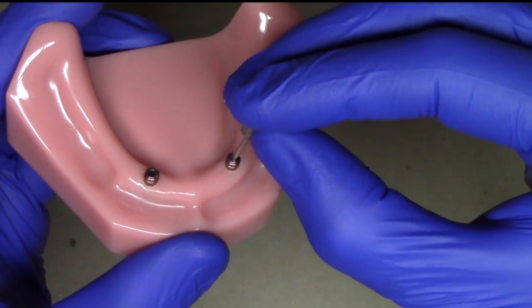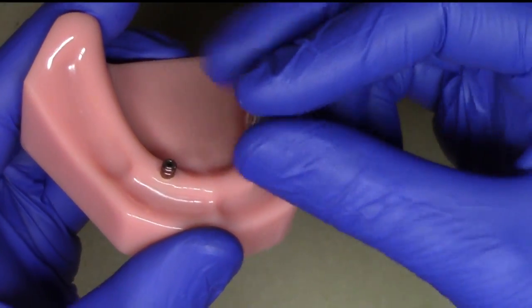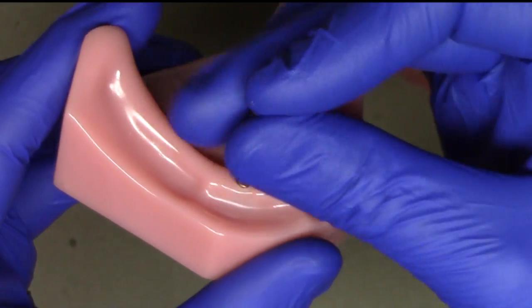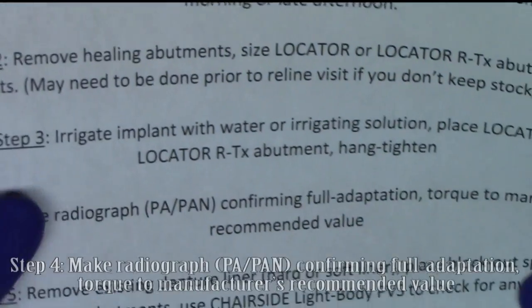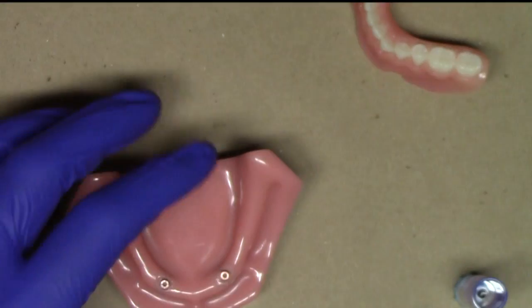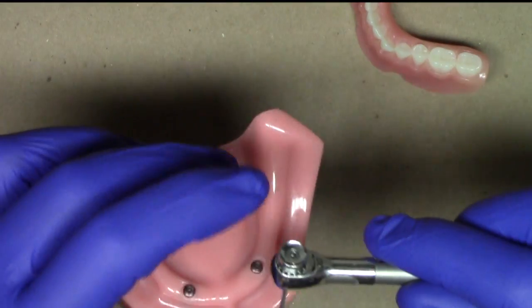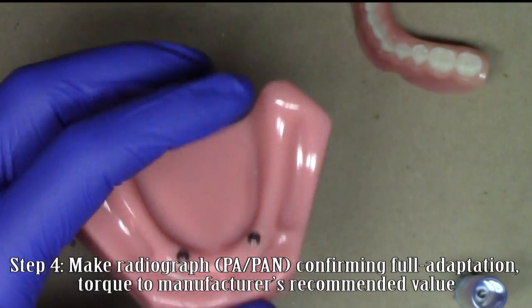Once I have initially placed the abutments, I use my hand driver to tighten them down all the way on both sides until finger tight. We're going to recommend making a radiograph — either a periapical or panoramic radiograph — to confirm full adaptation of the implant parts. After doing so, I take my torque indicating ratchet and torque down until I reach my manufacturer's recommended torque value.